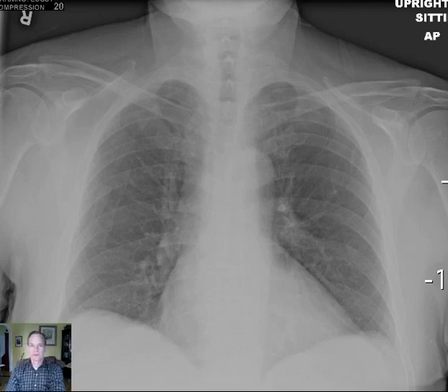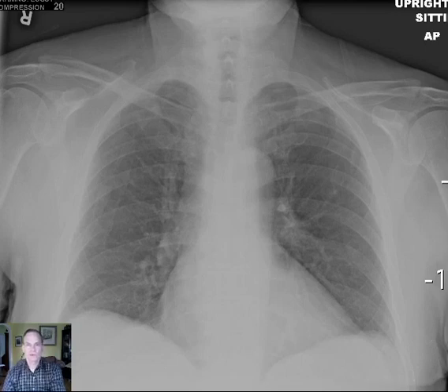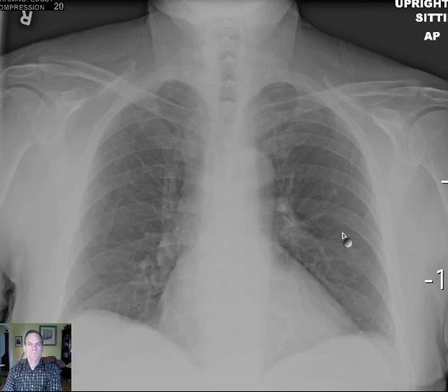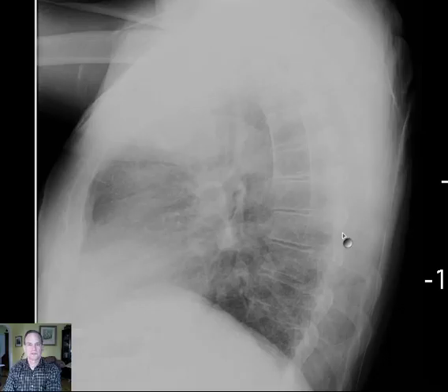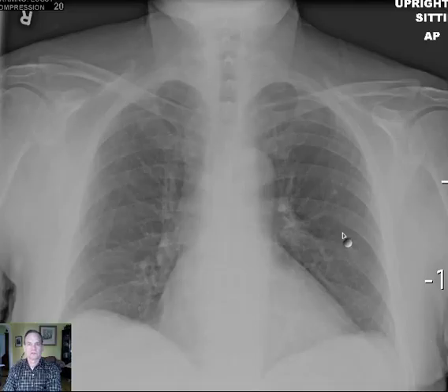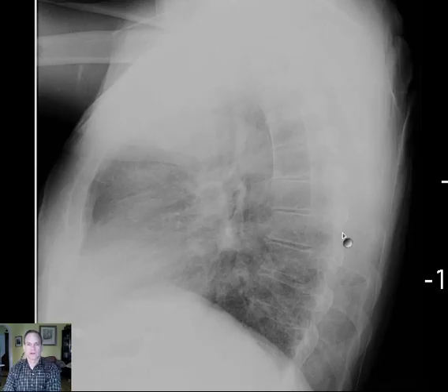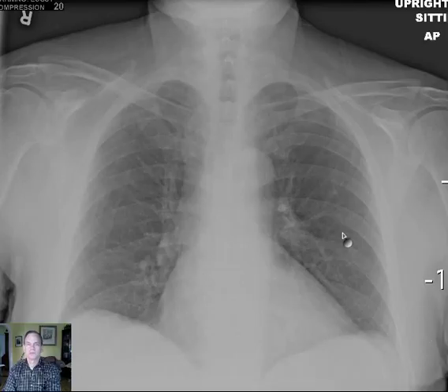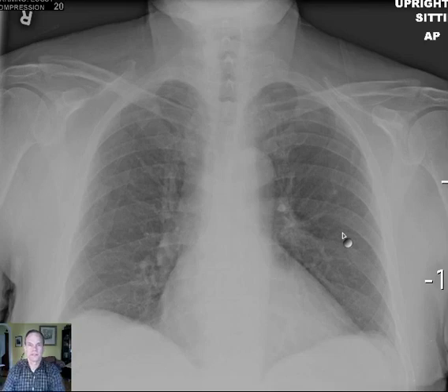Hello there, this is Dr. Mintz. I have a very interesting case here of an 81-year-old male who came into the emergency department with cough, shortness of breath, as many people do, and this chest radiograph was obtained.